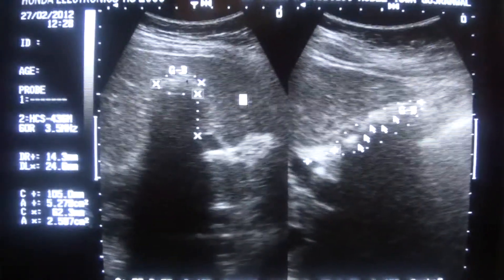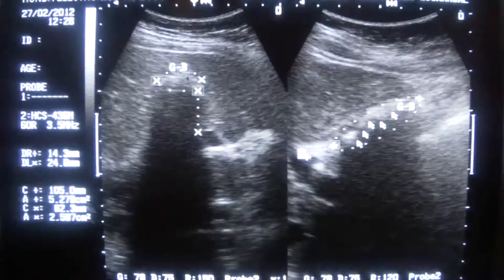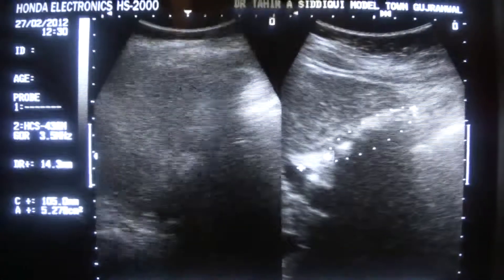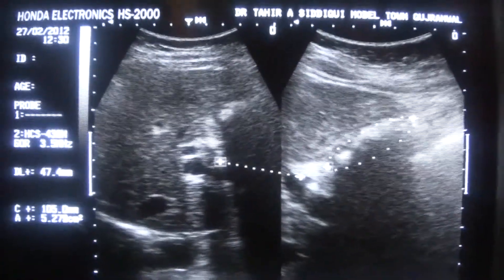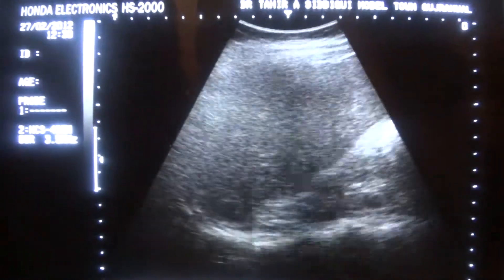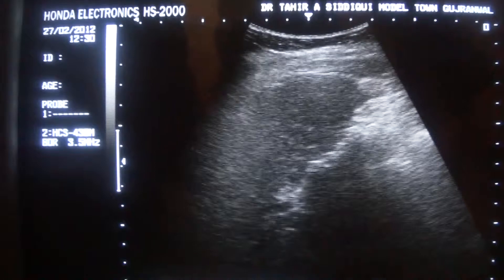This is the longitudinal section, this is the transverse section. However, if you don't see any relation with the portal vein, relate such an area in the liver accordingly. If it appears to be within the liver and is related with the portal vein, then it is the gallbladder. Always also check the common bile duct in such cases. This is the portal vein, and this is the common bile duct, which is not dilated. So this is an ultrasound study of a gallbladder that is collapsed and no lumen is seen.